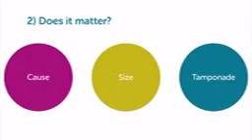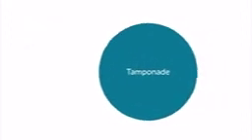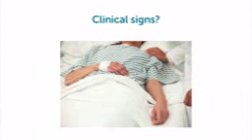This is, for me, the best evidence that the therapeutic effect of whatever was done in this patient was effective or not. The last issue we have to look into is whether or not the patient has tamponade. Now, tamponade, in essence, is a severe clinical condition, and patients who have tamponade have to be symptomatic in one way or other. So expect to see symptoms of either hypotension, dyspnea, tachycardia, or edema, or maybe all of them together. Tamponade is on the far side of hemodynamic compromise.